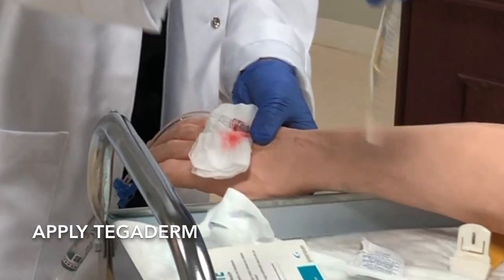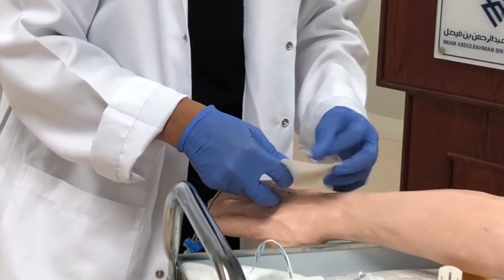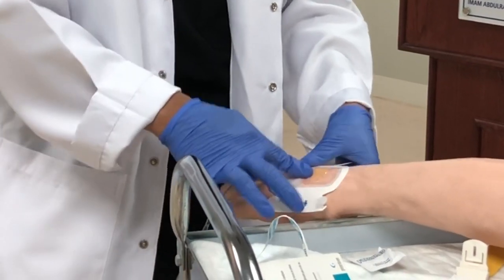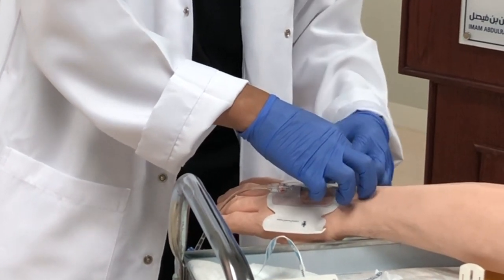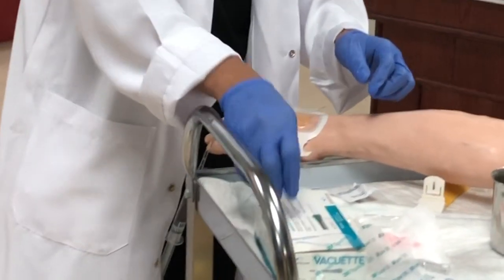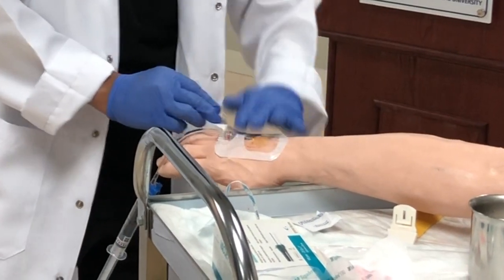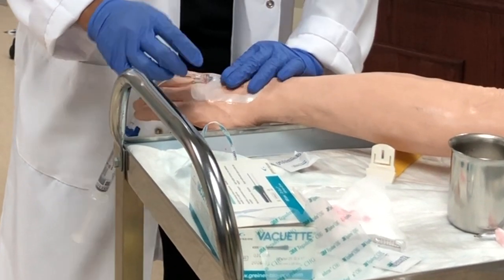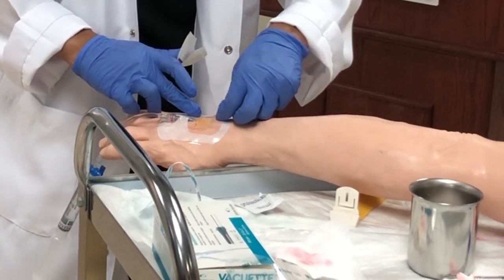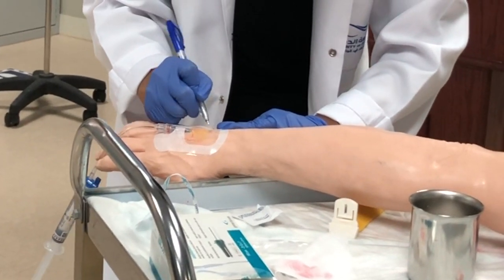Put on the tegaderm dressing. When you apply the tegaderm, apply it so that half of the hub is included under the dressing. Remove the backing on the other side. Write the date on the dressing label — today is October 15, 2020.